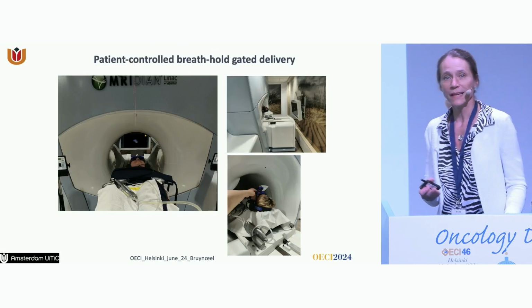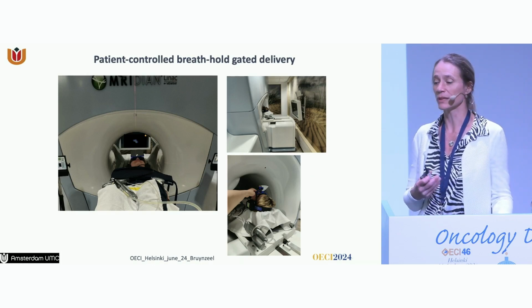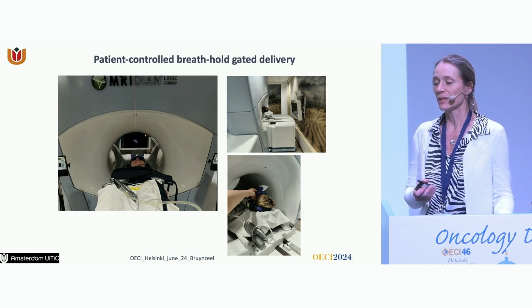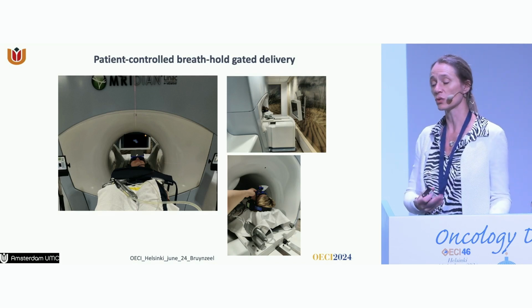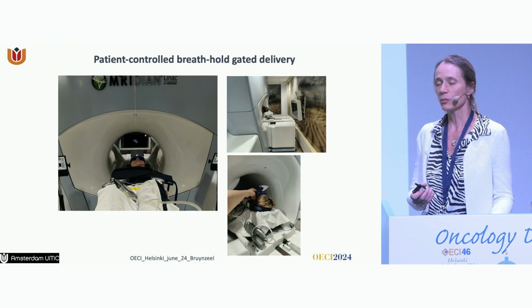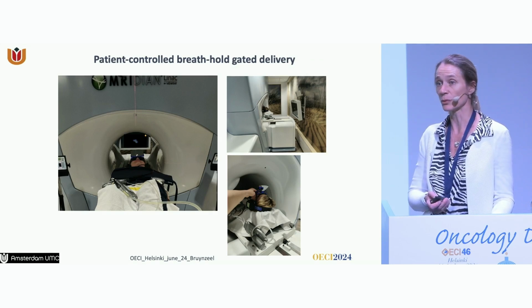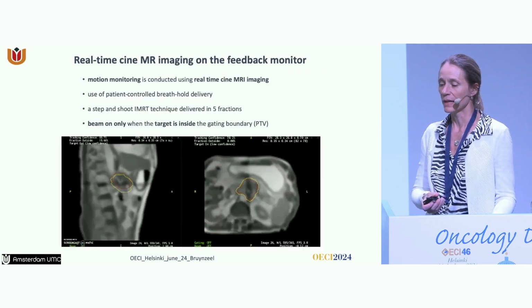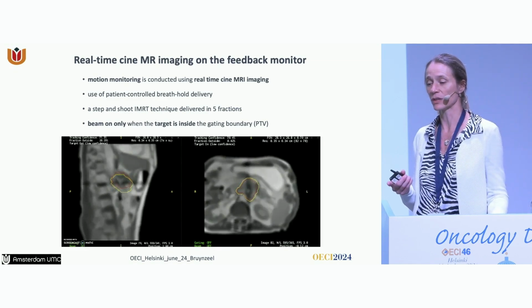During treatment, gated breath hold delivery is performed in all patients with upper abdominal and thoracic lesions. And we developed a patient feedback system where the patient can actively help with his own treatment and breath hold. This is performed using a pair of glasses, a mirror, and a monitor at the end of the bore. And here you see an example of what the patient actually sees during treatment.